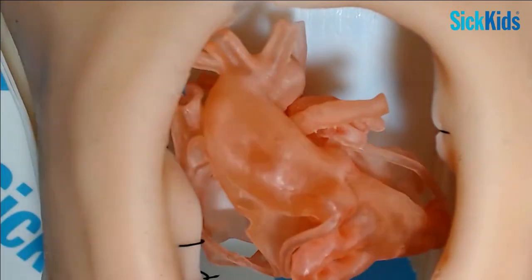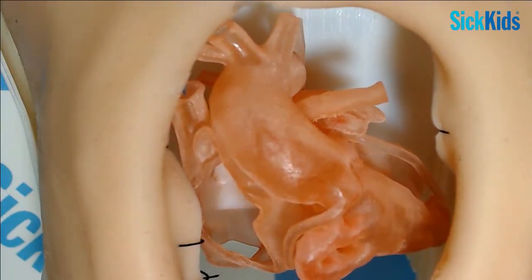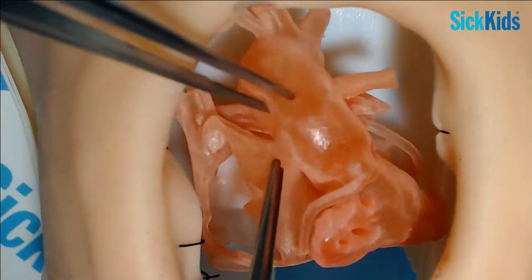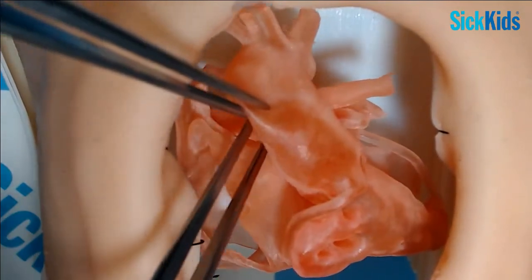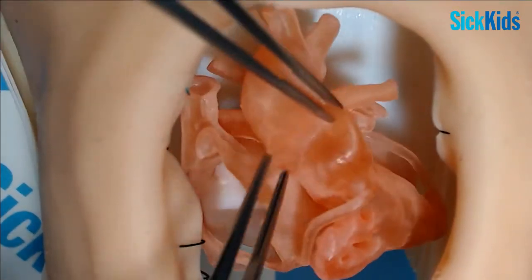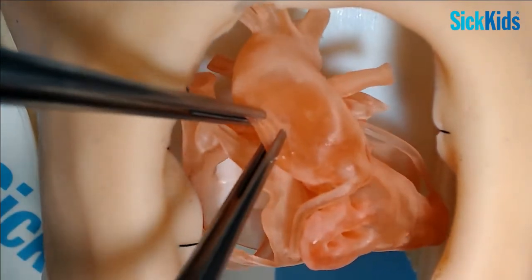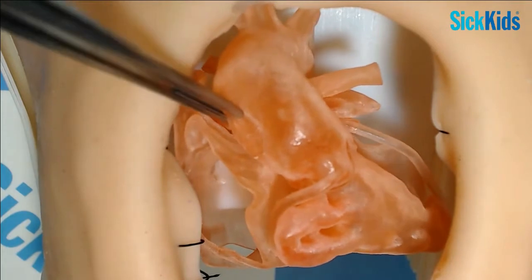The problem about doing that is that you transect it and then sew it back together, so you will shorten it when you put it back together. So there's less room. You're reducing the space behind the truncus for your pulmonary arteries to live and thrive in behind. So that's where you've got to decide. I must say usually I just open the trunk and then decide whether I can get them out on a button rather than take them out entirely.